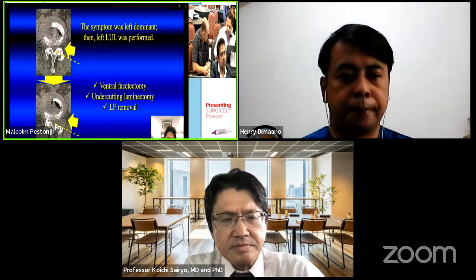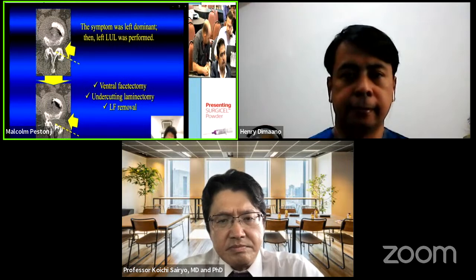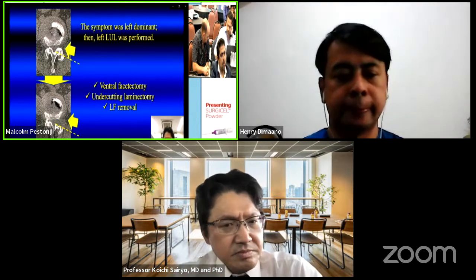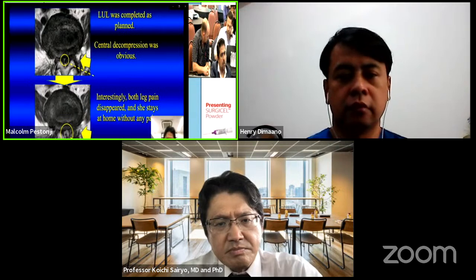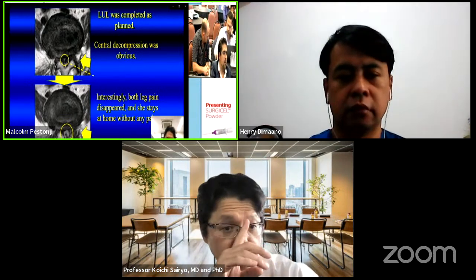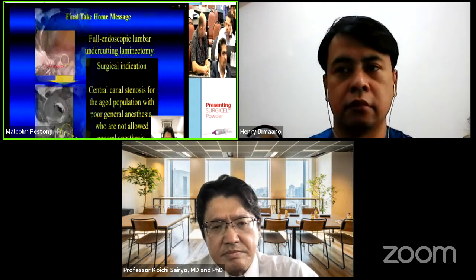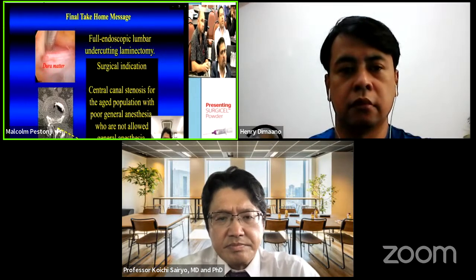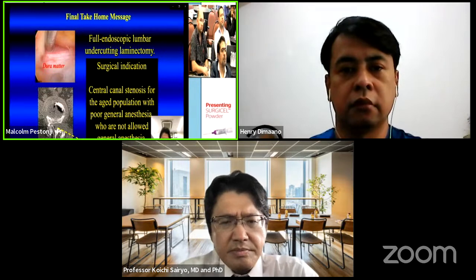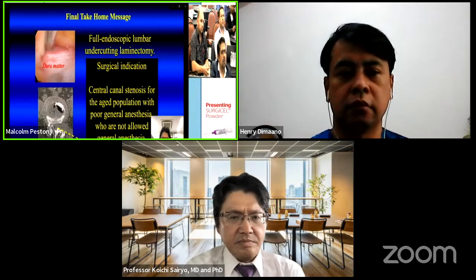This is before and after surgery, CT scan. I cut it, removed the SAP, and did the undercutting laminectomy. I planned and I did it. This is after surgery. Interestingly, both leg pain disappeared by left side decompression. In this final take-home message, lumbar undercutting laminectomy is an option for central lumbar stenosis in patients with poor general conditions for general anesthesia.